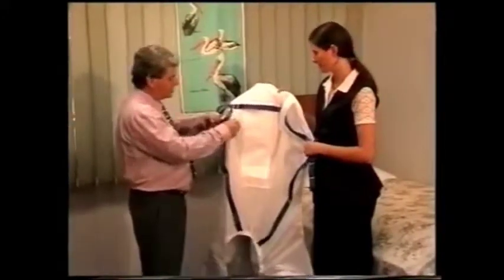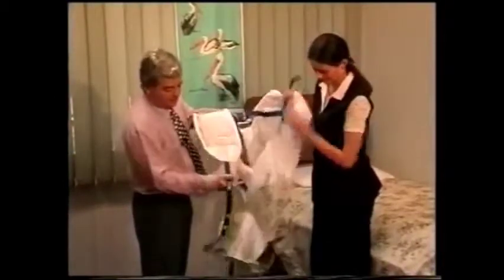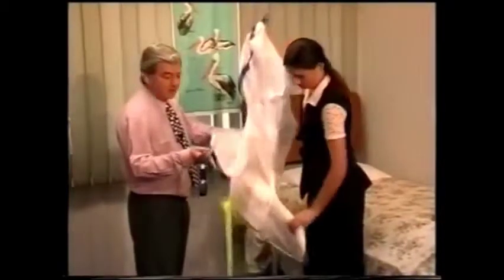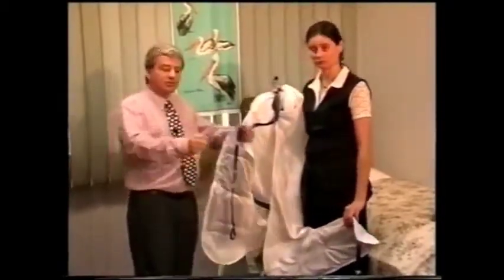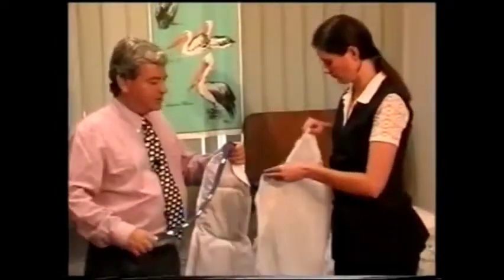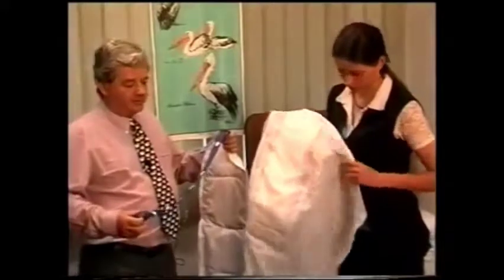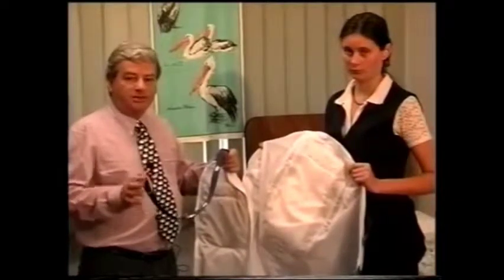However, we've got different settings on the head section and on the leg section. And if you use the different settings, then you'll be able to get the patient into a good sitting position, so there's no need to pull back as I go down. We started doing this a few years ago, and we found that having the patient in a good sitting upright position, they weren't as scared as they were before.